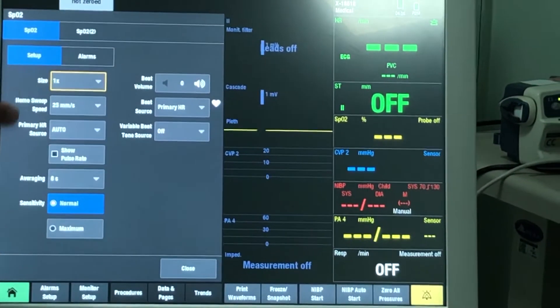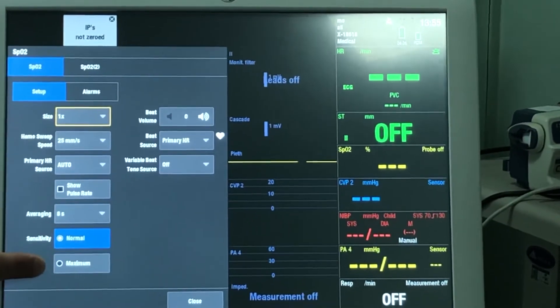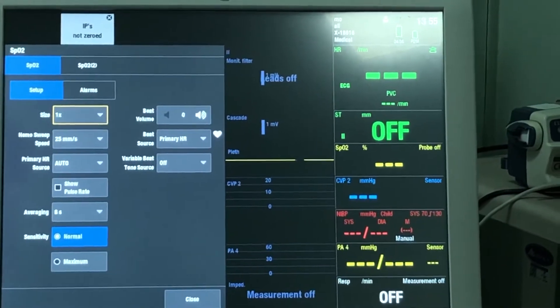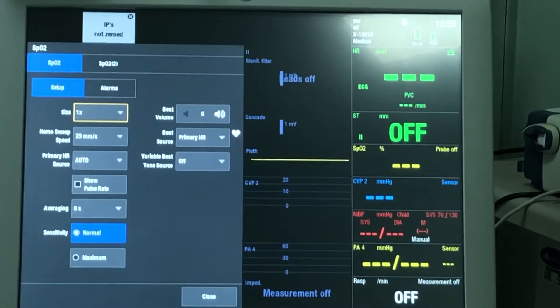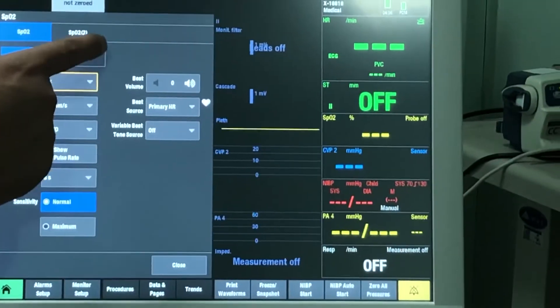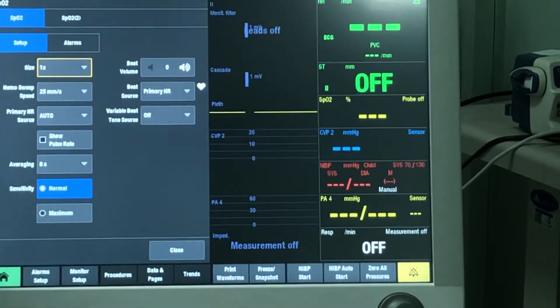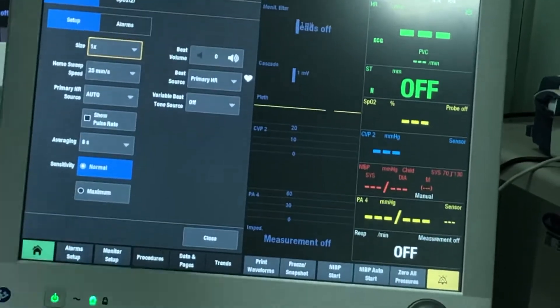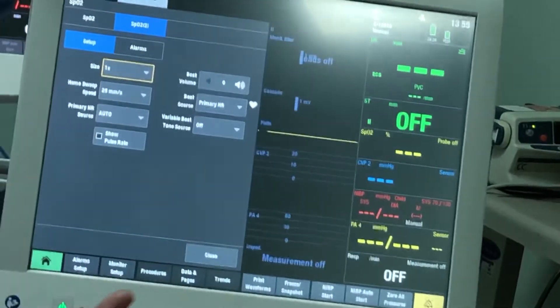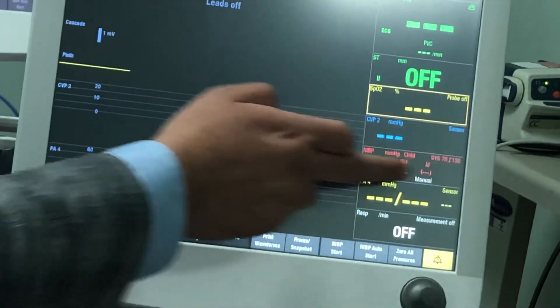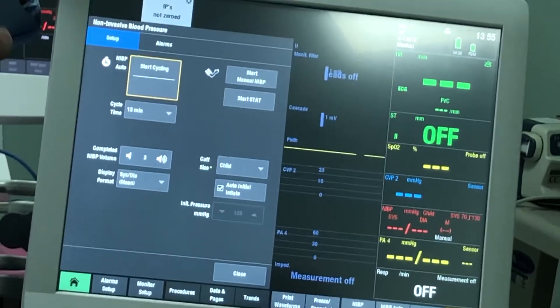Pressing on SPO2 brings up all SPO2 settings — size, waveform, sweep speed, primary heart rate source, and probe sensitivity. Sensitivity can be set to normal or maximum, which is useful for patients with dead skin on their fingers where detecting pulsations is difficult. Two SPO2 probes can be connected to one patient, primarily for neonatal patients where probes are placed at different sites. Press on the second SPO2 icon to configure its settings.